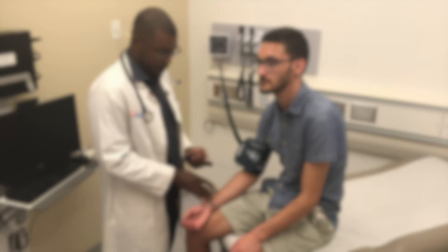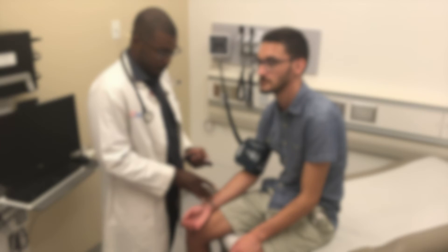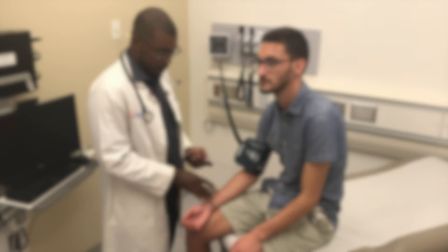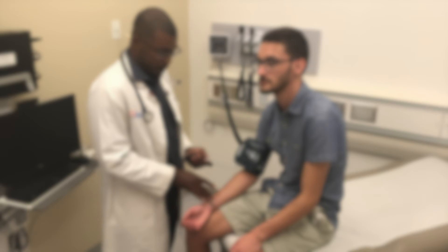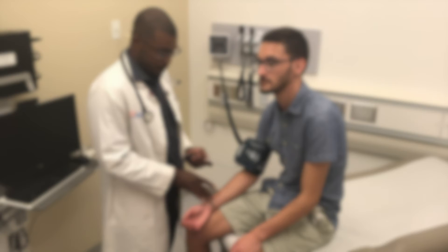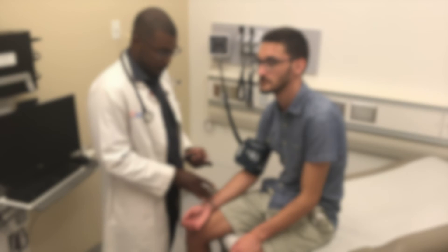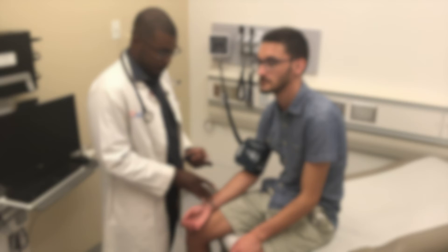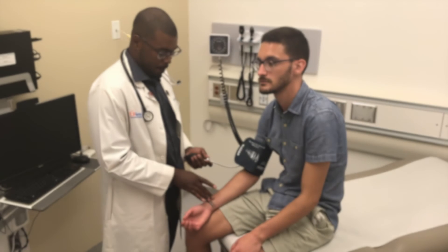As you will see in the clip, the actual mechanics of this special test are quite simple. Rather, the difficult part is knowing when to use it. As we unpause the video, you will observe the demonstrator palpating the radial pulse as he inflates the blood pressure cuff. In order to save time, we have not shown the demonstrator retaking the blood pressure with the standard method, as this would simply be a repeat of what you saw in parts 1 and 2.